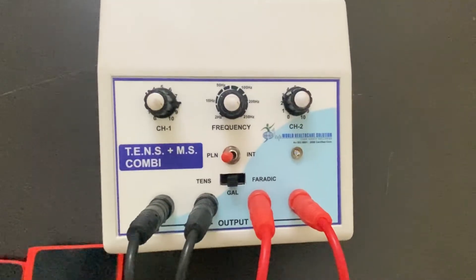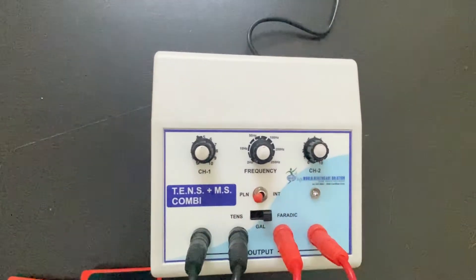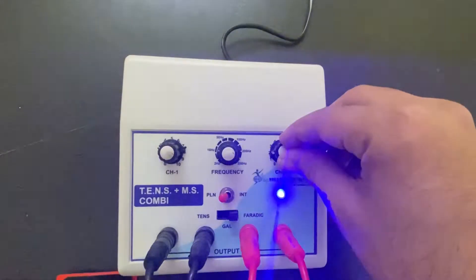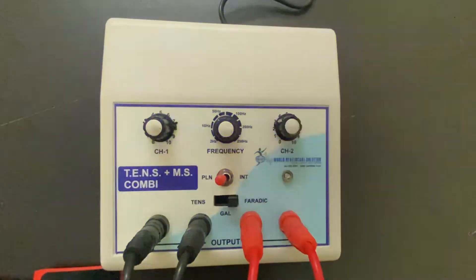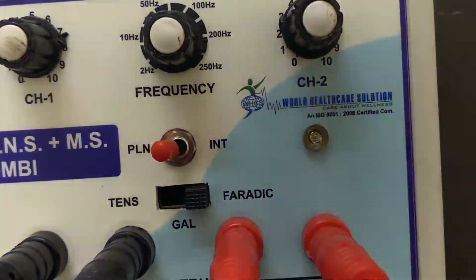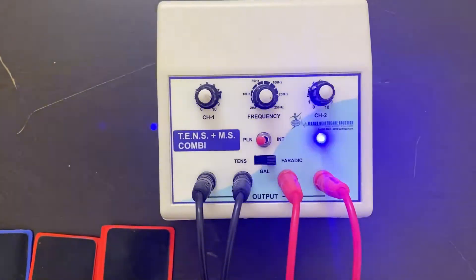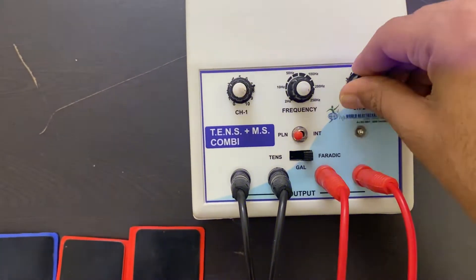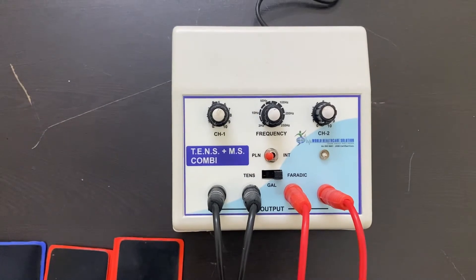The demonstration for galvanic mode is completed. Again, switch off the knob and set the mode to Faraday mode. Set the intensity — the machine is ready to use. Once the demonstration or treatment is completed, simply turn the knob off and then switch off the machine. The demonstration is completed.